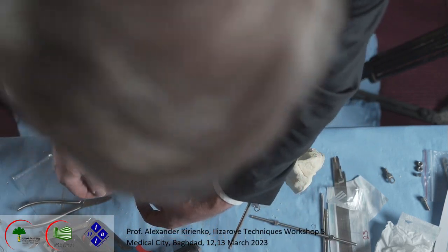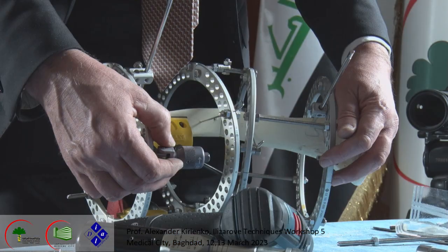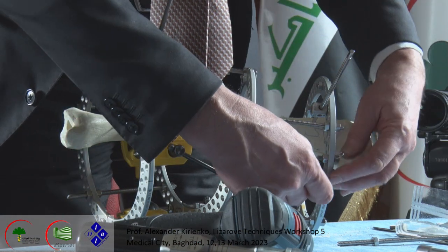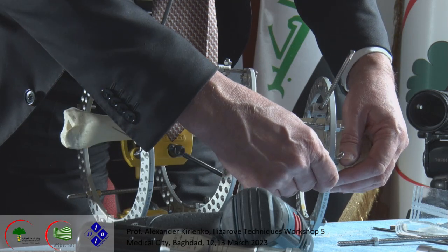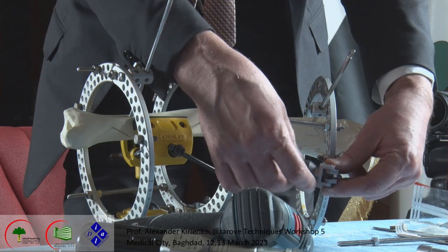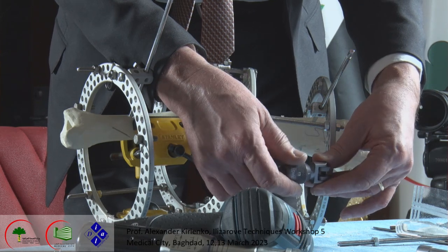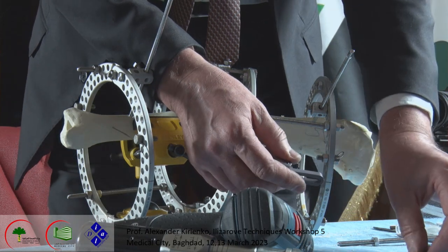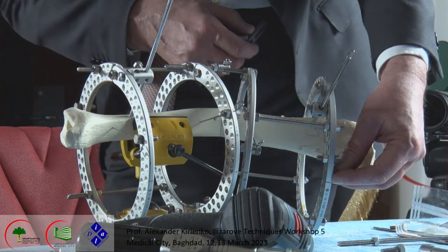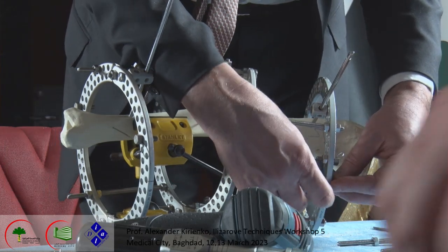for correction of the deformity. How we put this, or vice versa, we will put like this. This motor should be put in the middle. Okay. Do you have this? Yeah. Yes. Okay.